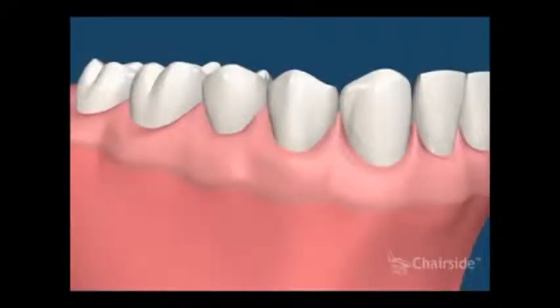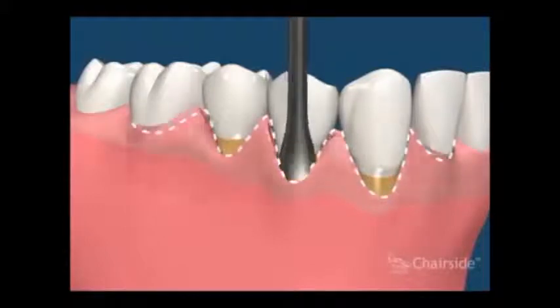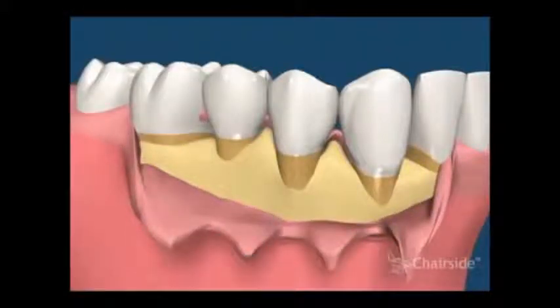Teeth may experience recession, where the roots become exposed. This movie demonstrates a situation where some teeth have also lost their tough gum tissue, or attached gingiva. Attached gingiva holds the gums firmly to the teeth and prevents calculus or tartar building up between gums and teeth. To treat this condition, the flap is reflected from the teeth.